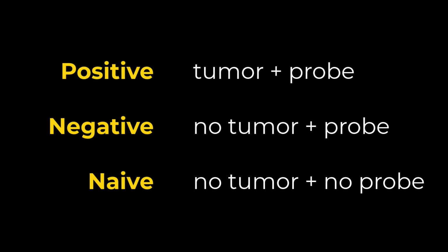Now that we've discussed the control groups, let's move on to the actual experiment. Our goal is to image the biological activity involved in 4T1 tumor progression using fluorescent approaches.